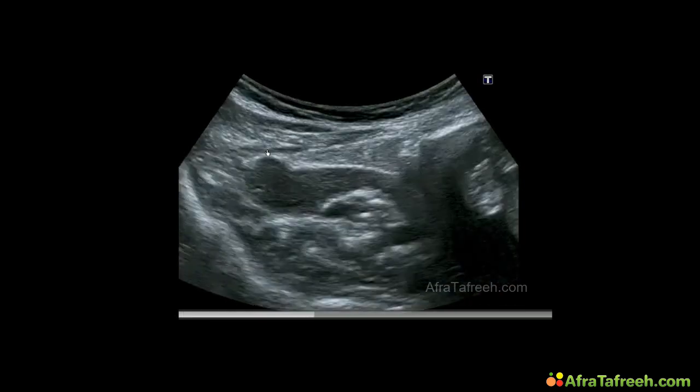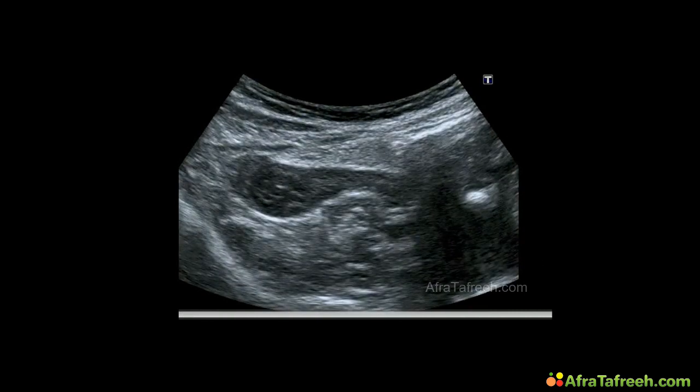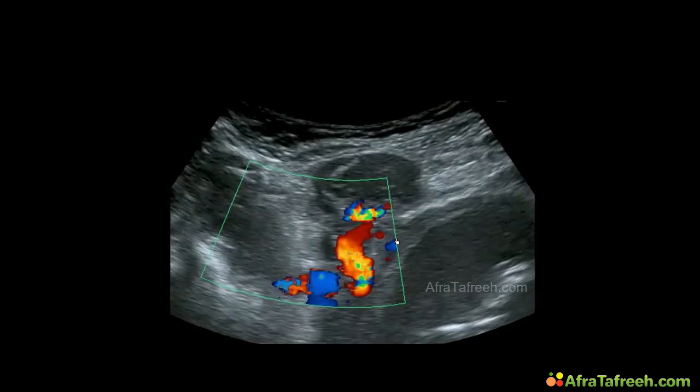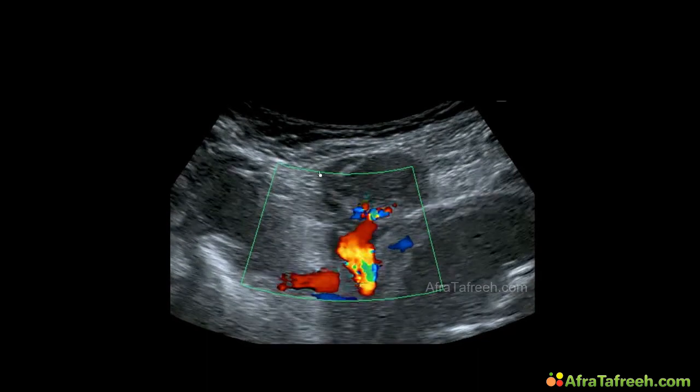Once again, we see the fallopian tube, the pregnant uterus, and the ovary on this side. In this video clip, we can nicely detect the artery reaching and supplying the ovary here.